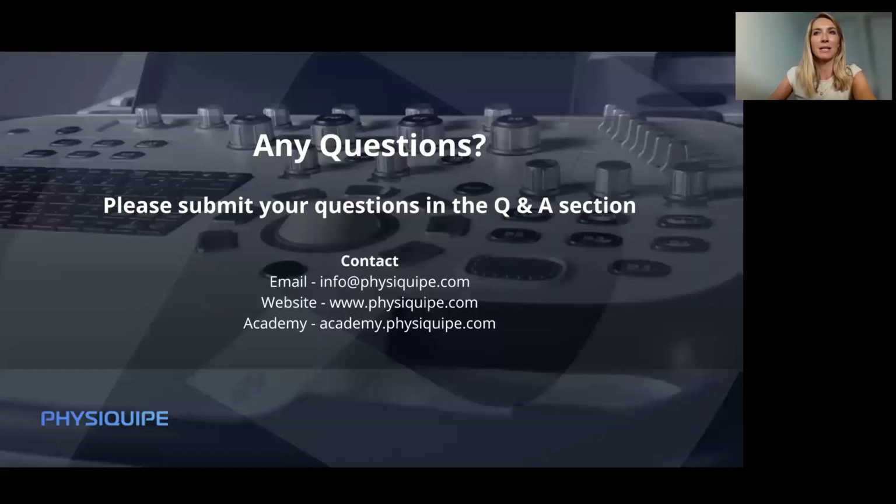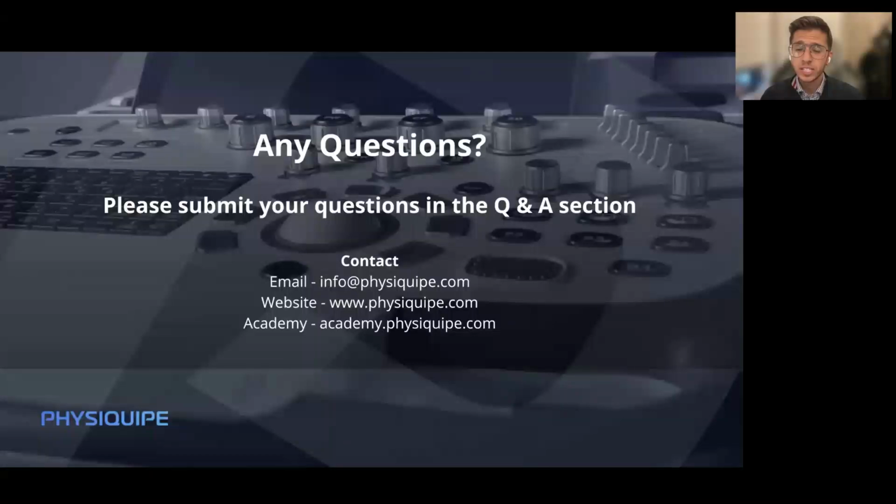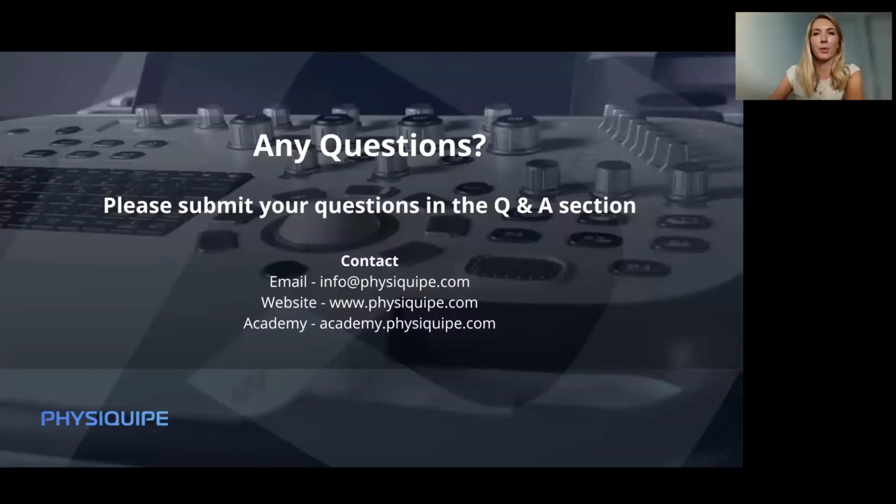Okay, great. And then you mentioned spinal because we had a question about how useful diagnostic ultrasound for spinal indications could be. What would you be recommending on that side of things? On the diagnostic side, pretty limited. So there's some people who do feel like they can look at facet joint arthropathy on ultrasound. I've never seen it. I'm not fully convinced. It is becoming more and more used on the interventional side. So particularly facet joint injections, epidural injections. There are more and more clinicians now doing this under ultrasound guidance as opposed to X-ray, CT, or fluoroscopic guidance. So that's where I think the utility is. But from a diagnostic point of view, I think unfortunately pretty limited. Yeah, okay, that makes sense.